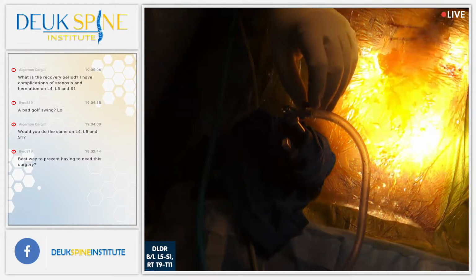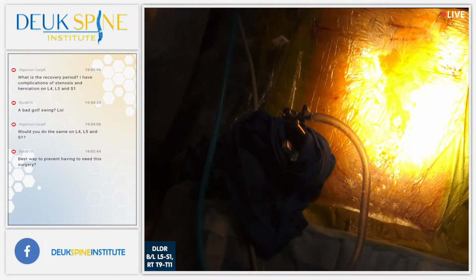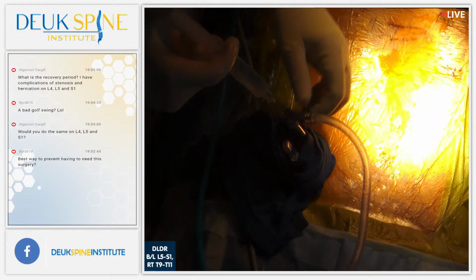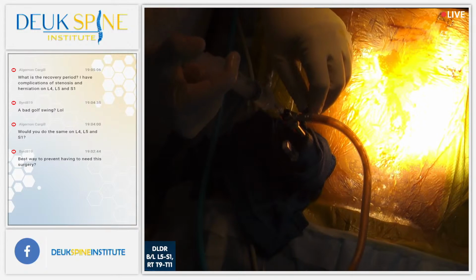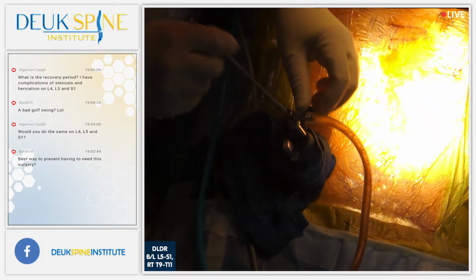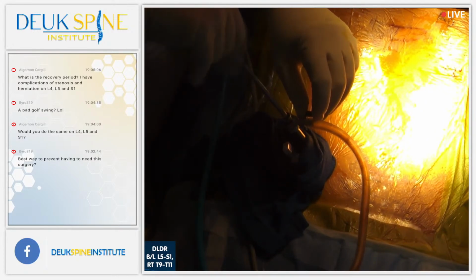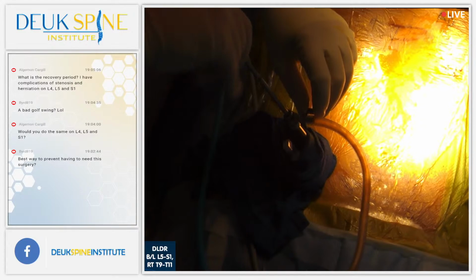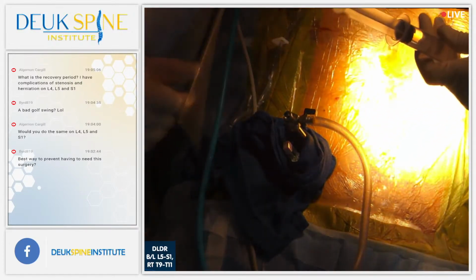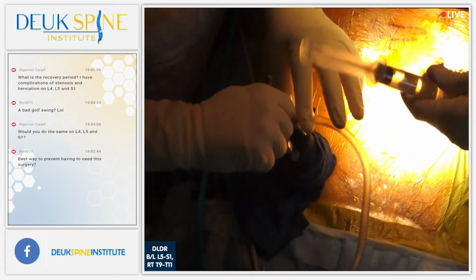We're literally coming from the outside of the foramen. And it's amazing to be able to do this safely. It is obviously high price real estate, no doubt about it, right? We could have a lung collapse, we could have a vascular injury, if we get out of line, we could injure the spinal cord if I'm not careful enough. This is a little sticky. Huh? I think it's just some disc material.